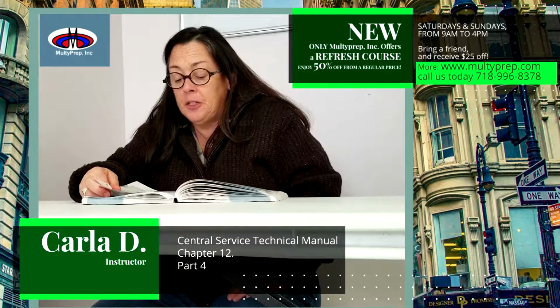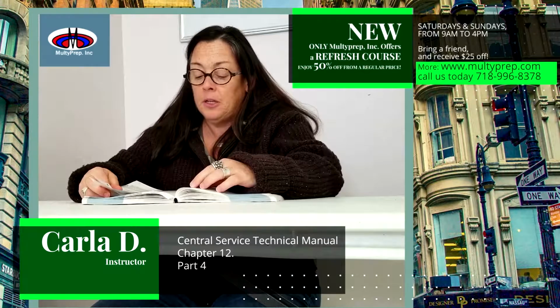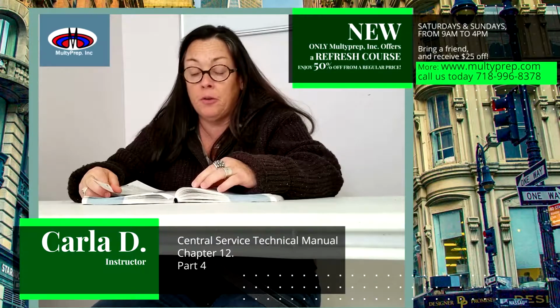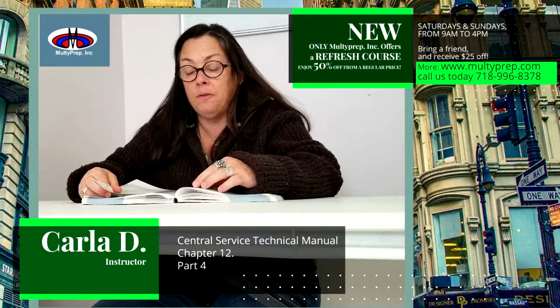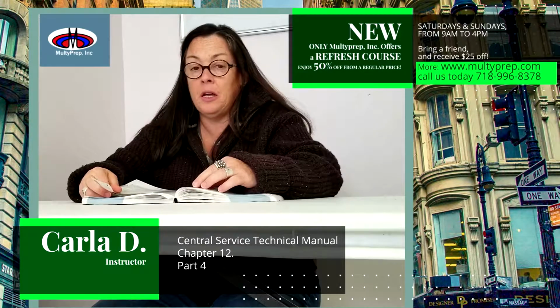If stains are discovered, the wrap should be relaundered. If stains cannot be removed, the wrap should be removed from service. Textiles must also be delinted as needed to minimize the risk of lint entering the sterile pack and ultimately the sterile field. See figure 12.31 for an example of delinting. Reusable textiles can be a significant source of lint. If lint enters the patient's incision, it may cause negative effects.